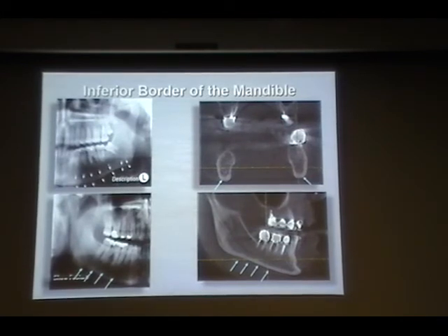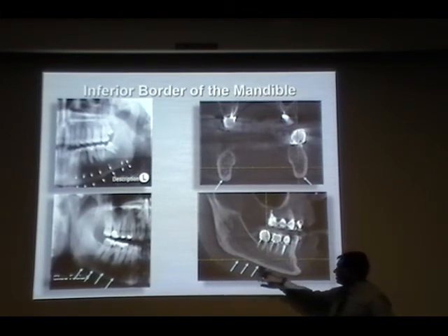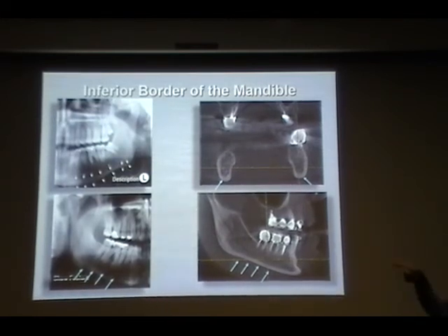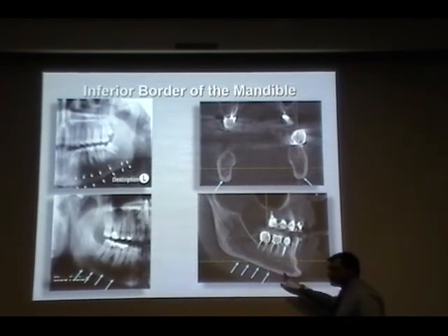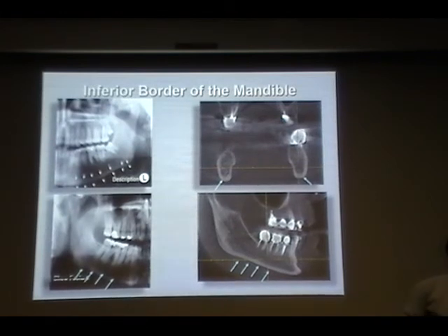Inferior alveolar canal, and this one is the inferior border of the mandible. When you are evaluating, try to see that this is at least 3 millimeters, because if it's less than that, then we have to consider the patient having osteopenia, as Brian asked before. So here generally we check, and if it's less than 3 millimeters, then it is suspicious for osteopenia.